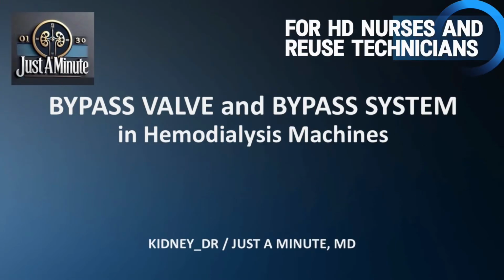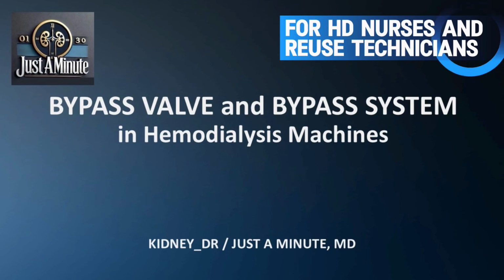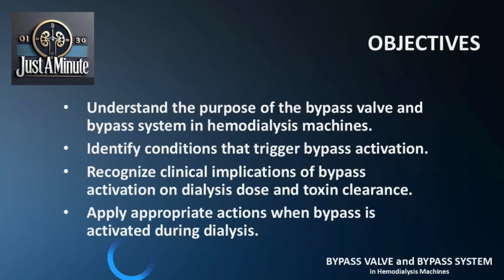Today, we'll discuss one of the most important safety features in hemodialysis machines, the bypass valve and bypass system. These components ensure that only safe dialysate comes into contact with the patient's blood. Before we begin, let's look at our learning objectives for this session.